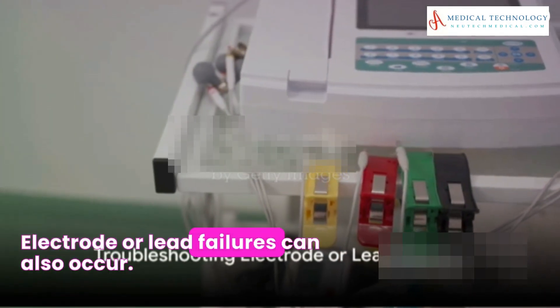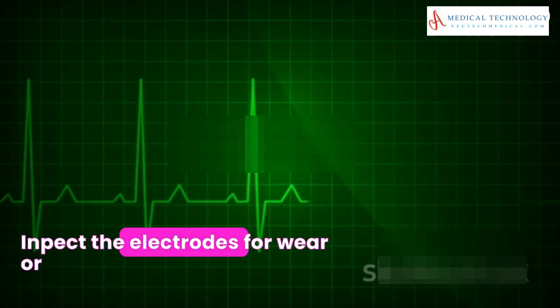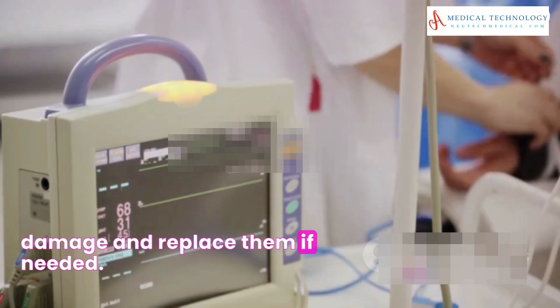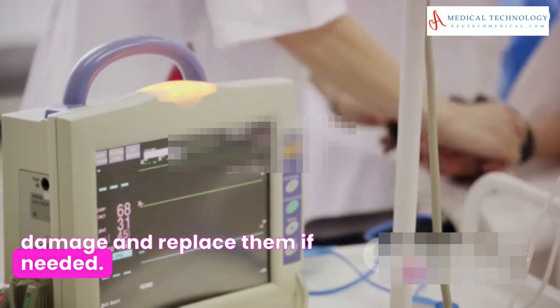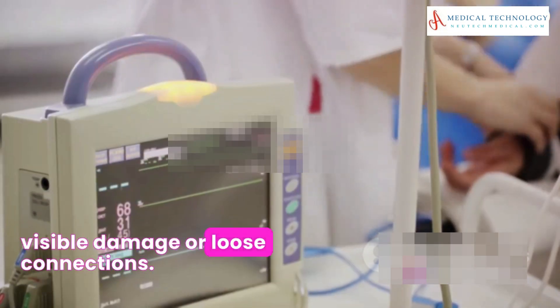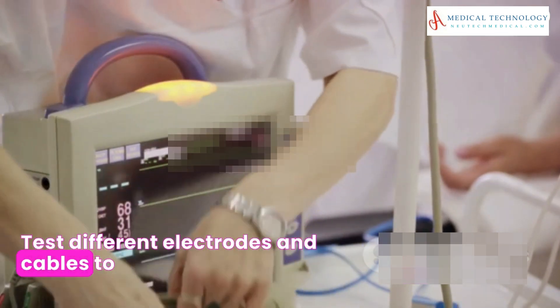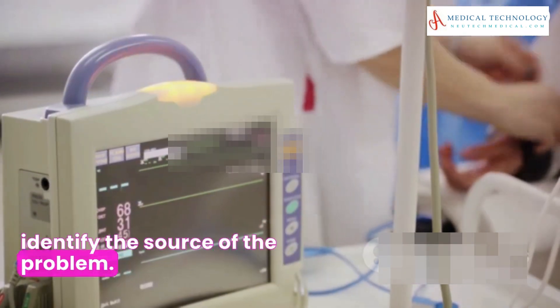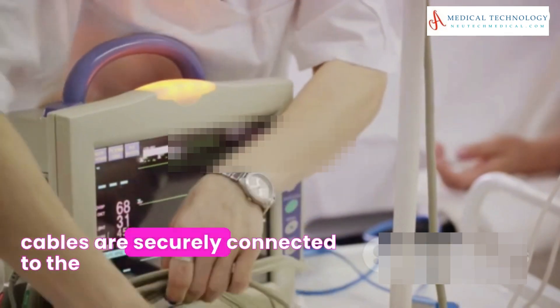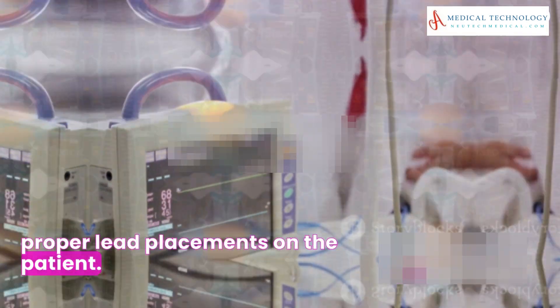Electrode or lead failures can also occur. Inspect the electrodes for wear or damage and replace them if needed. Check the electrode cables for visible damage or loose connections. Test different electrodes and cables to identify the source of the problem, and ensure the electrode cables are securely connected to the proper lead placements on the patient.